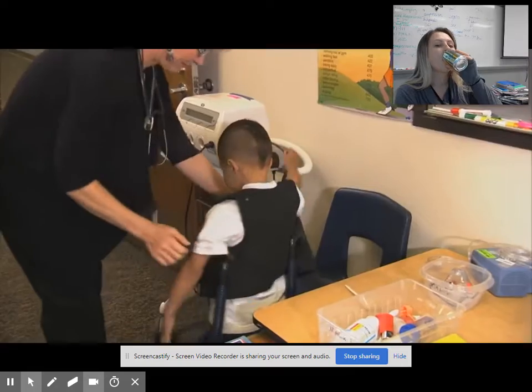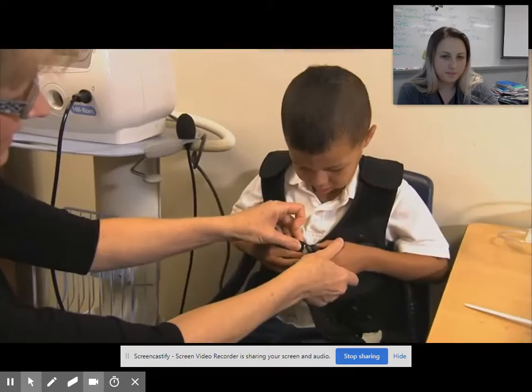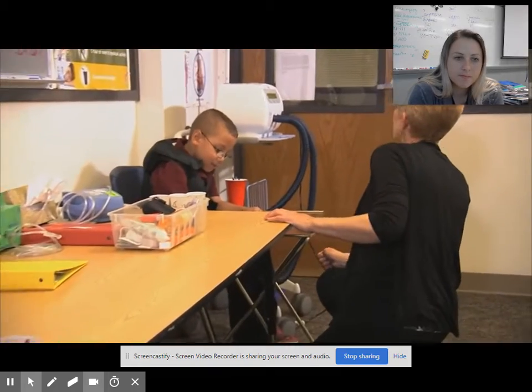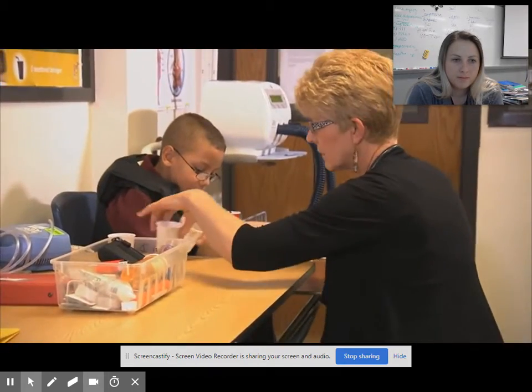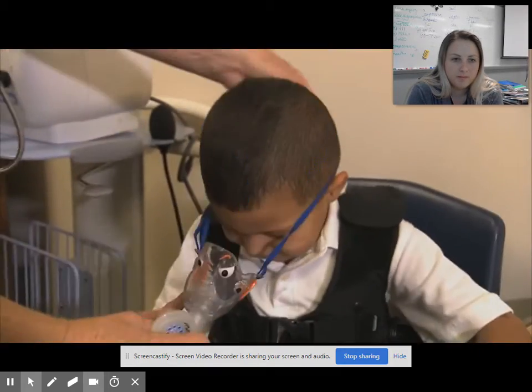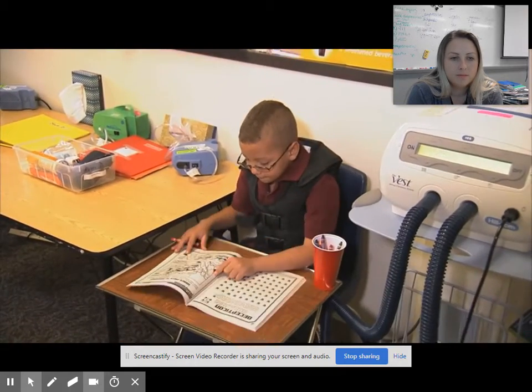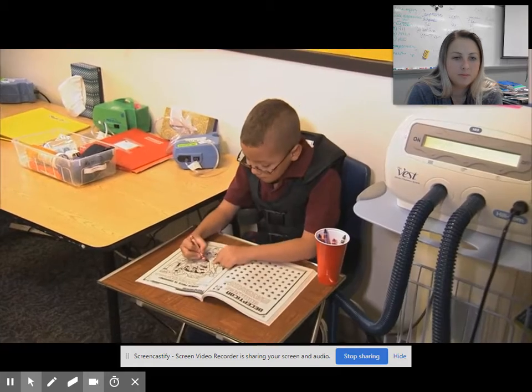Neither of them. Here, the nurses listen to them. They hear what's going on with them. They sense when something's off. First thing in the morning, we do the vest therapy. The vest therapy is used to vibrate the chest and lungs in order to lessen the congestion, which makes it easier for them to breathe.